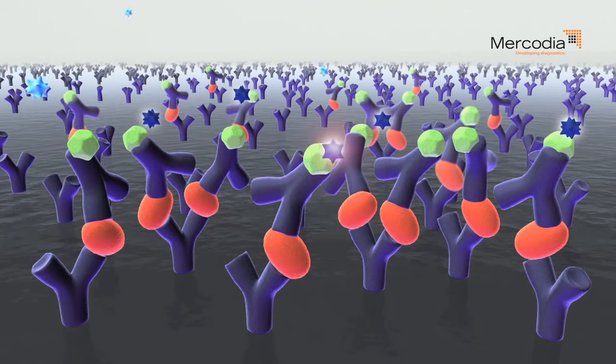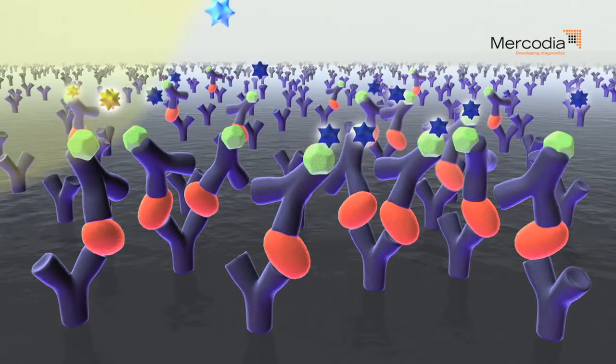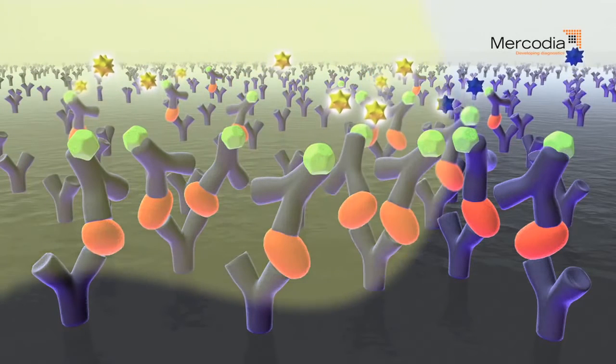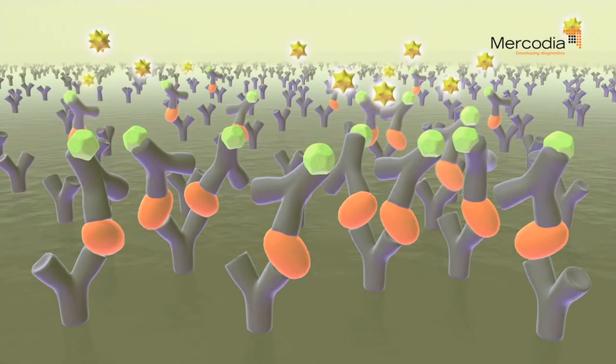Substrate is added, which is converted by the enzyme to a chromogenic signal. The enzyme reaction is stopped and the result is monitored spectrophotometrically.